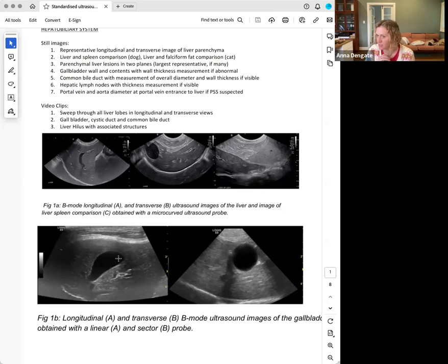Cool. And you say it might be a shunt. We need to know whether this is a surgical liver problem, so typically I'd say let's do a CT angio and a true cut if we don't find a shunt under the CT.